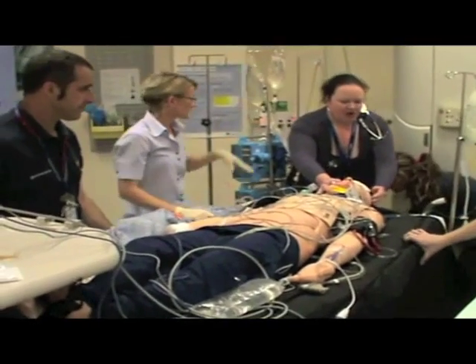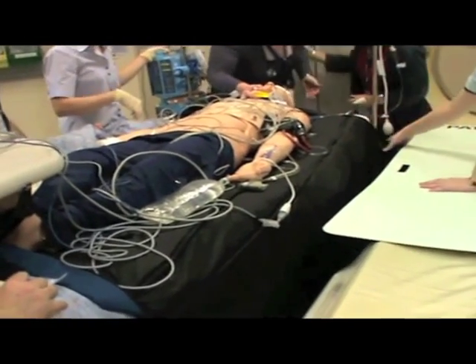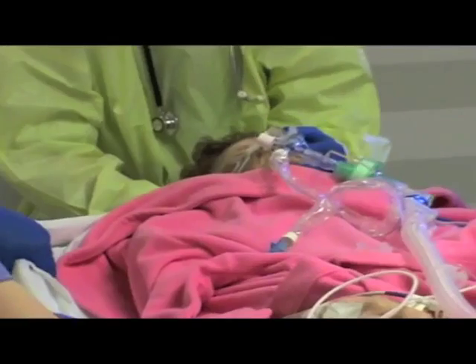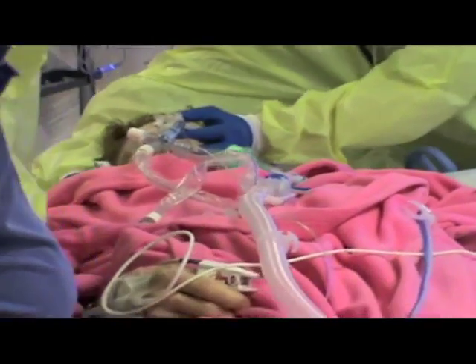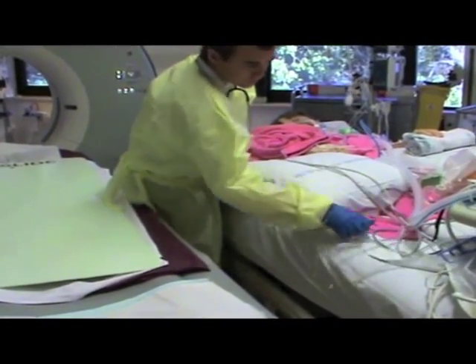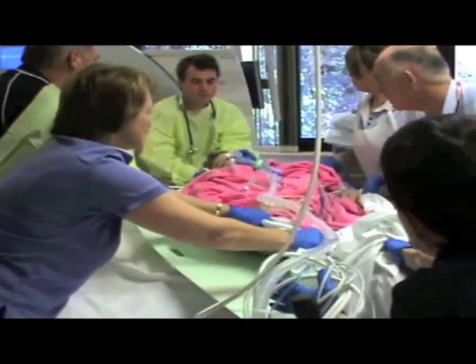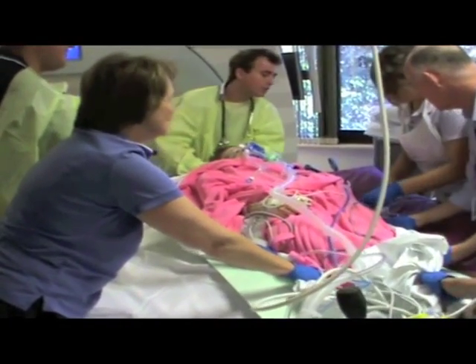Given this responsibility, when moving the patient from bed to bed, the person at the head end is often the team leader. The movement occurs on their instruction and the patient is moved as one. Before movement, try to anticipate what cables and tubing will come under tension and prevent this if at all possible. If unsure, the patient can be moved in stages. For example, move them halfway, then reassess.